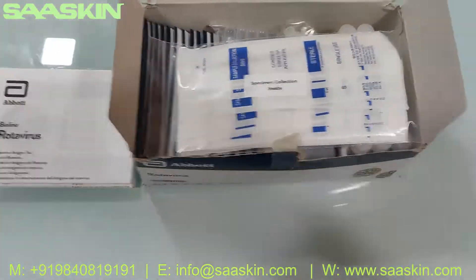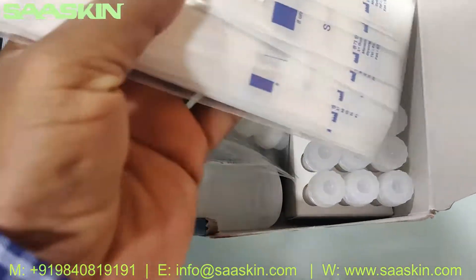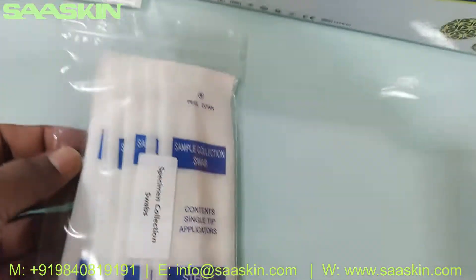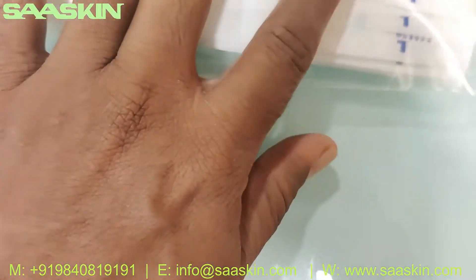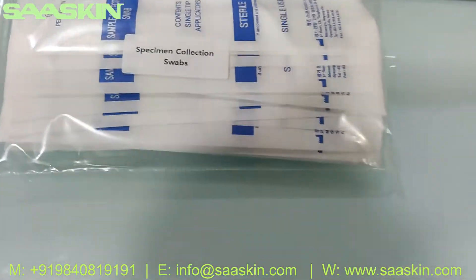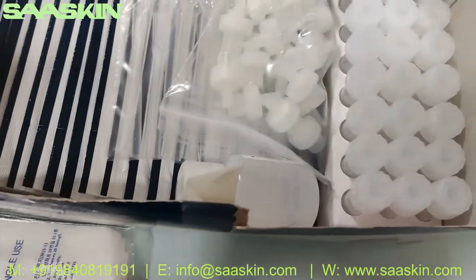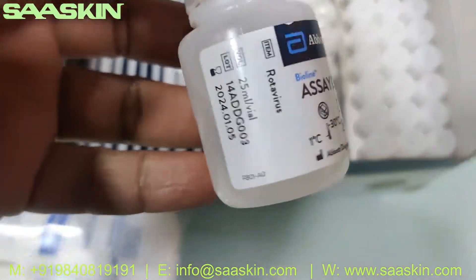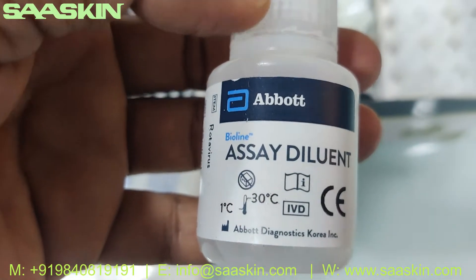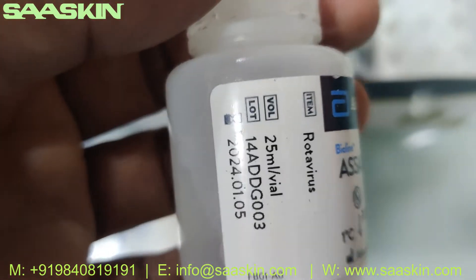Let's get inside the pack. You can see we have the specimen collection swab sticks, which are sterile ones — you can see them here. And then inside the box you have the buffer diluent. For this 20-test kit, you can see it is CE certified and it's a 25 ml vial.